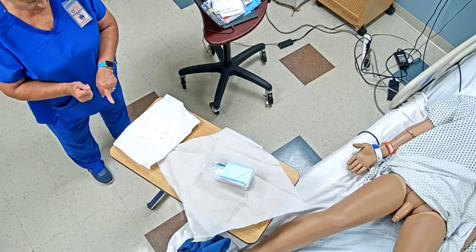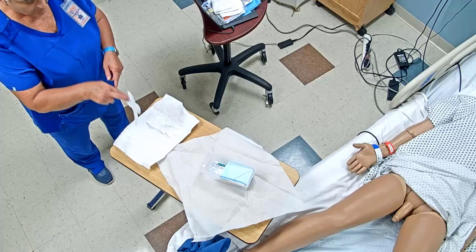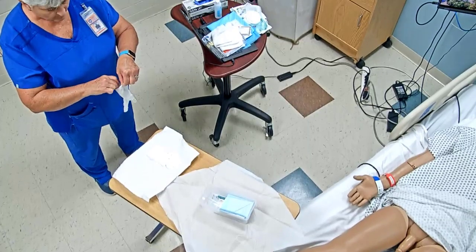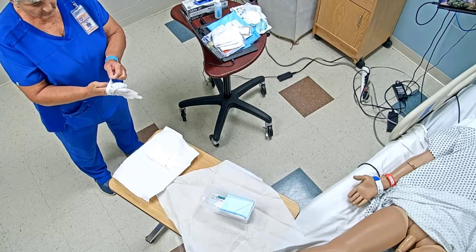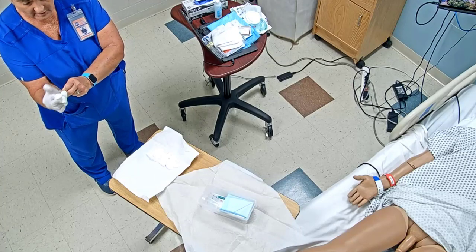So I'm going to go ahead and reach over here and pick up, I could do it with either hand, this is the part of the glove that's going to go next to my skin. So you saw that I could move it back and forth. I'll open that up, slide, go ahead and get my fingers spread. I'm going to get that in there, just touching on that part.